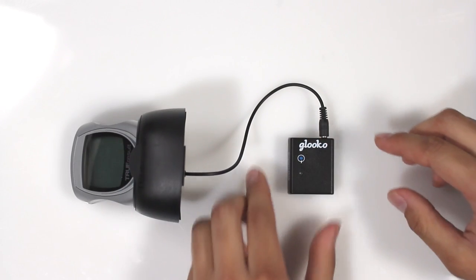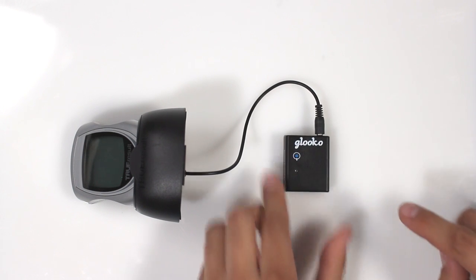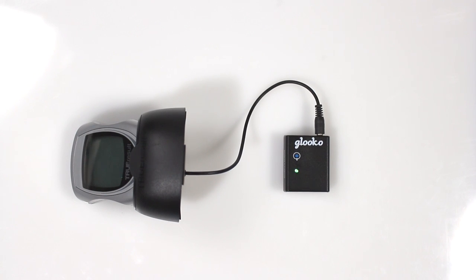Turn on the Gluco Meter Sync Blue by pressing on the blue power button for at least one second. If you have done this correctly you should see a flashing green light. That's it, you're ready to sync.